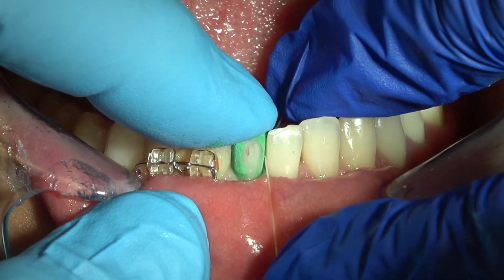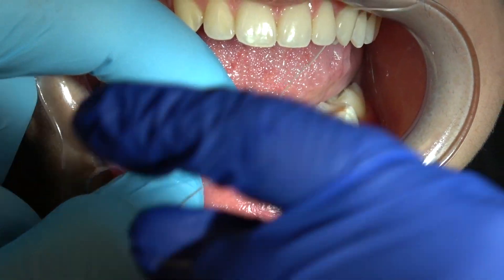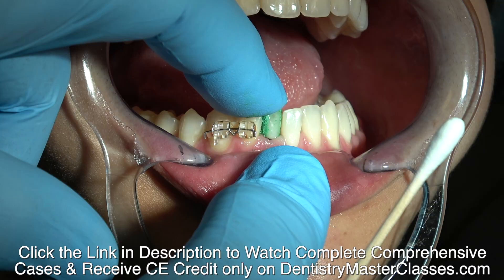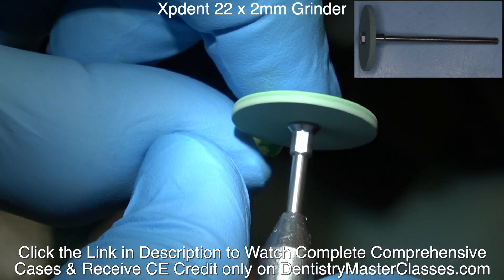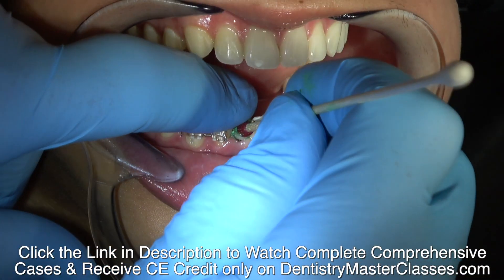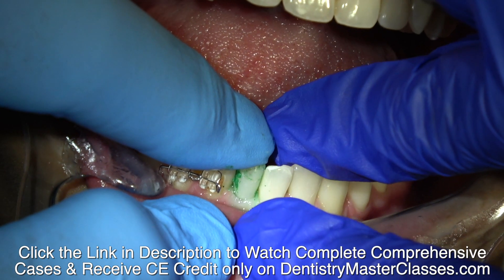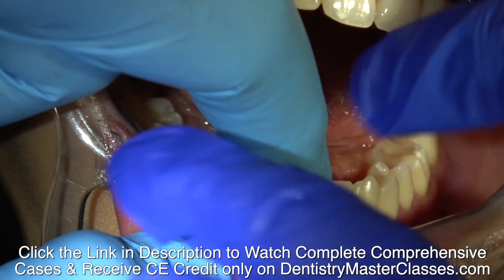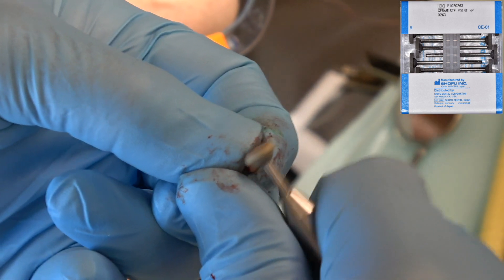I want the floss to pop through, but I want it to pass through — I don't want it to be stuck. This Syclude is very good for checking interproximal contacts — see, it goes all the way to place now. You've got to take your time when you're adjusting interproximal contacts because it's easy to take too much off one side and have an open contact. Don't adjust very much at a time if you ever do have to adjust a contact. This was a unique situation — hardly ever do I have to adjust interproximal contacts because we fabricate the crowns with finalized interproximal margins on a solid model. This was just trickier since it was a small diameter implant. Good solid fit now — flush on the shoulder, tight contacts but not too tight.